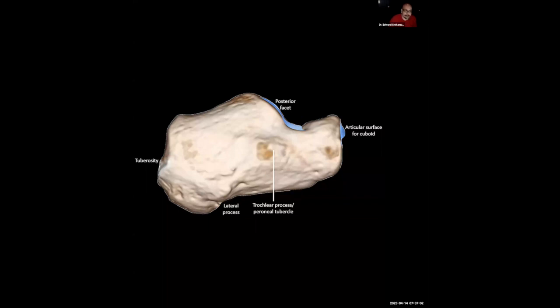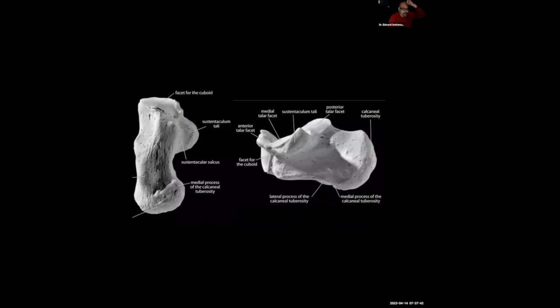And why is that important? Because now if a closed fracture becomes an open fracture with overlying soft tissue disruption, or even pressure necrosis because the fractures are not reduced properly before definitive osteosynthesis, you can get pressure necrosis and loss of skin, converting a closed fracture to an open fracture. And my traumatologists don't like that when that happens, because now you have to deal with an open wound and potential infection, making subsequent management more difficult, as you can imagine. So important to try to highlight this for our traumatologists on imaging, but hopefully they also see that clinically, okay?